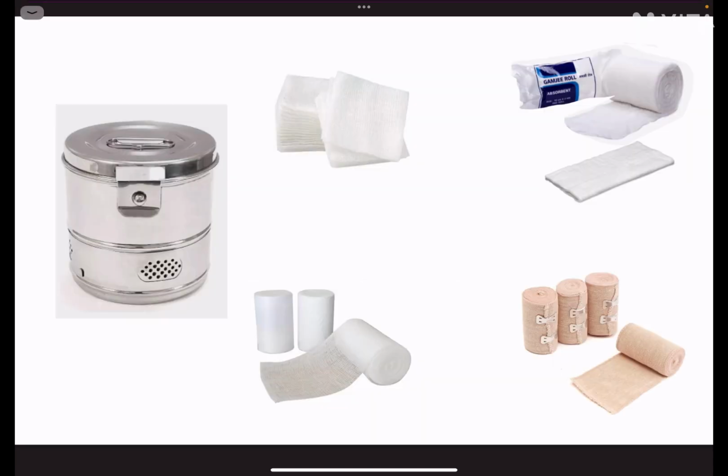Surgical drum. In surgical drum, we keep the sterile roller bandages, gauze pieces, Gamgee rolls and Gamgee pads and crepe bandages. Now, if you can appreciate, there are multiple fenestrations at the lower part of the cylinder. During sterilization, we keep this fenestration open, and once the sterilization is done, there is a belt-like structure in the lower part of the cylinder. After the sterilization is completed, we rotate this belt so that the fenestrations are sealed by this structure and locked.